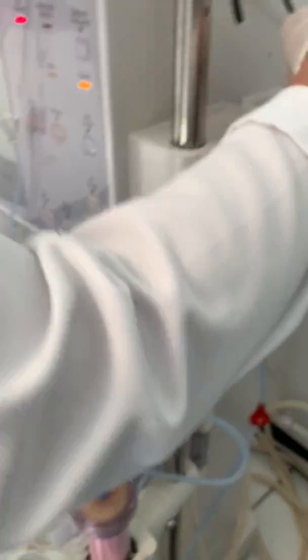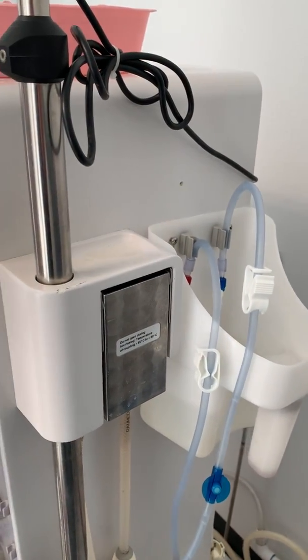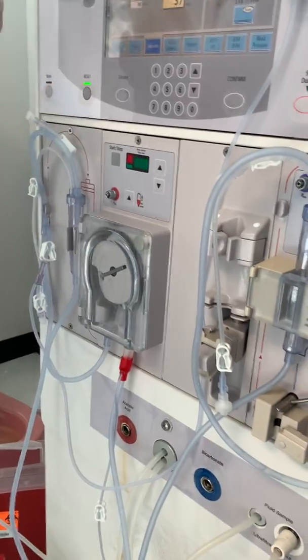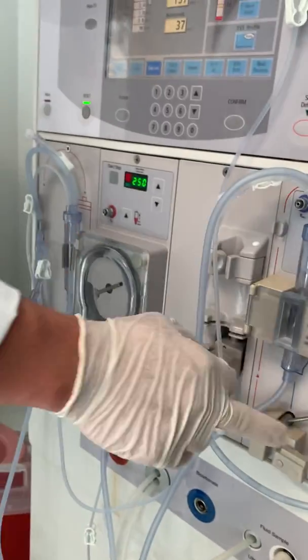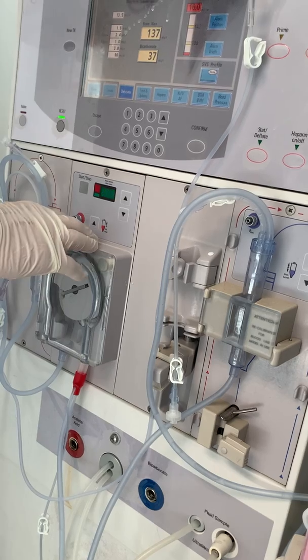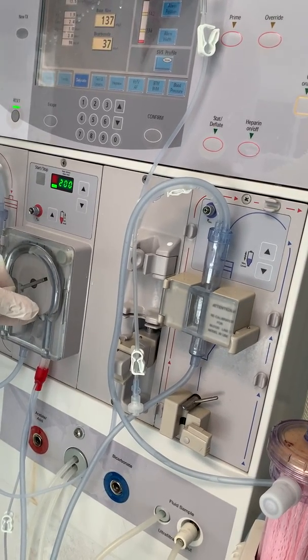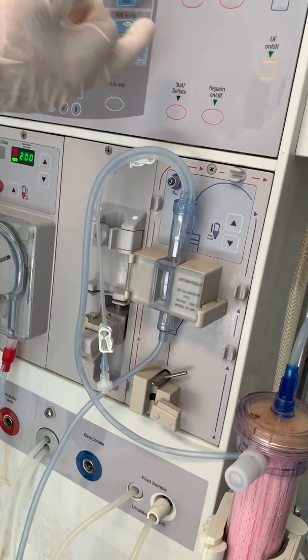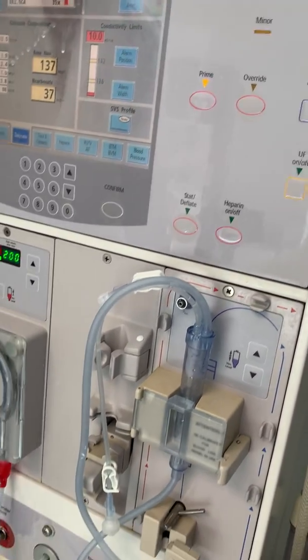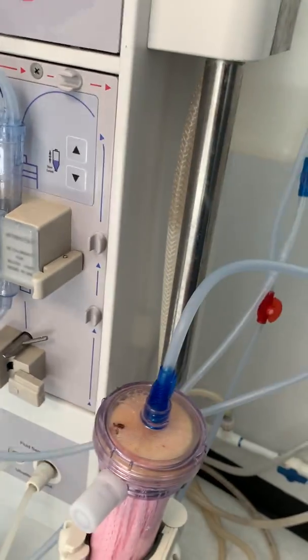Now we want to prime our venous line for about 200. In order to prime our venous line, we have to use a pump. With our arterial line we used gravity, but with our venous line we cannot use gravity — we have to use a pump. We'll drop this down to at least 200, depending on your company policy. Press that right there, and press your prime button — that will prime your venous patient end.